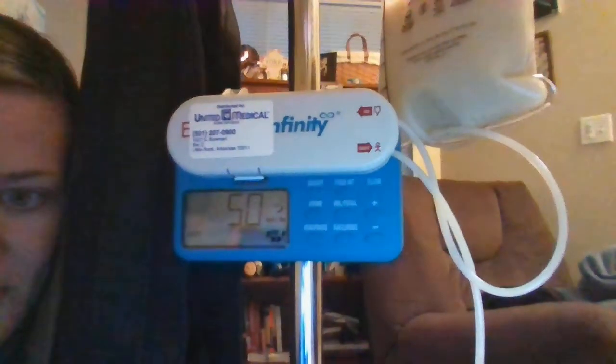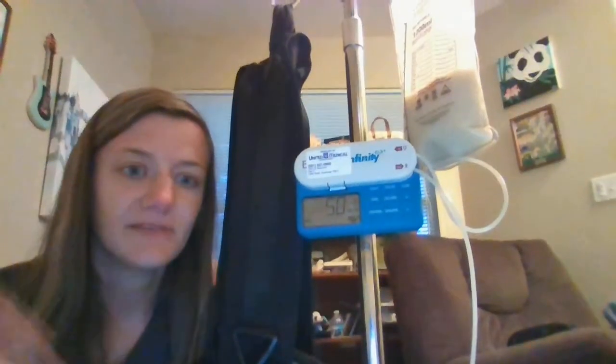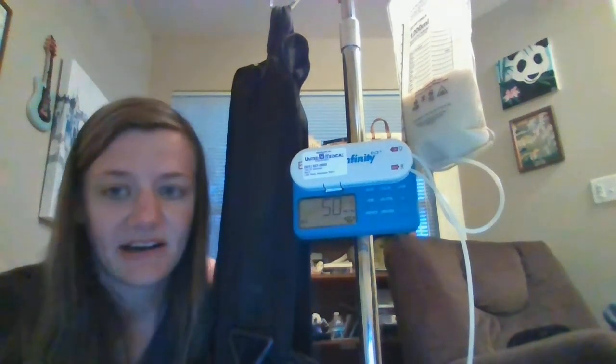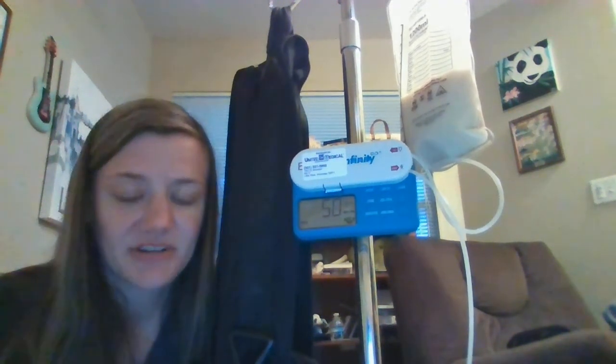So it's pretty cool. I have my rate on a low rate of 50 because, in all honesty, my small intestines do not tolerate high rates. I've been there. I've tried 80 mLs an hour. It was too much. It backed up into my stomach, and I was extremely sick right after I got my feeding tube placed. And you really have to be your own advocate because there's going to be some nurses out there that don't know what they're doing.